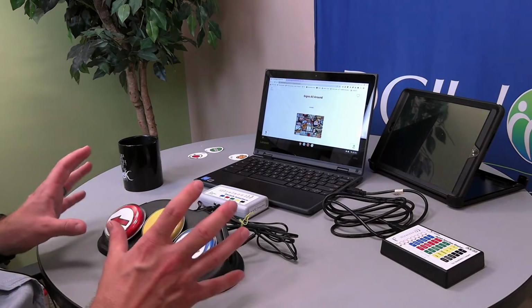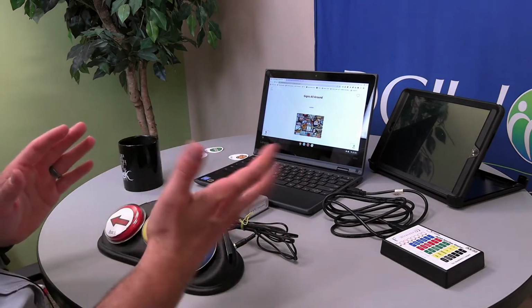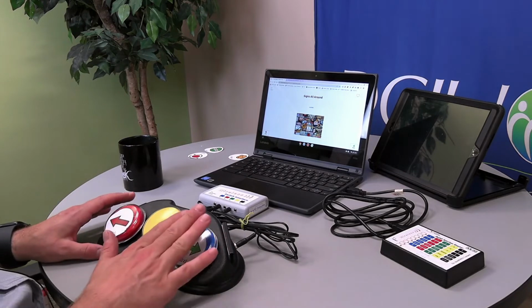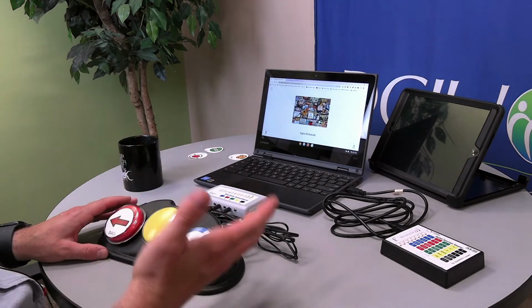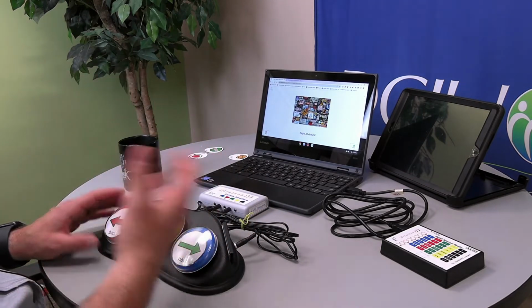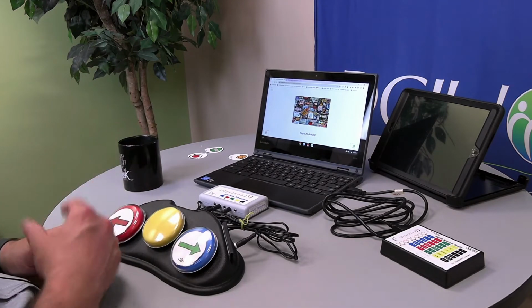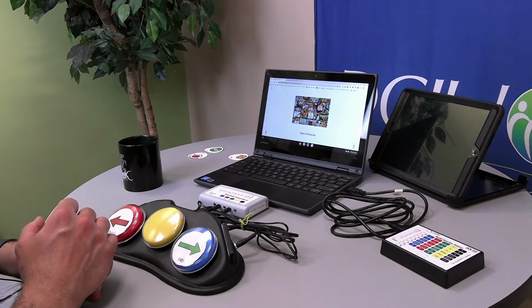Now that we have our device connected and we have everything routed to the computer, what we can do is simply press our designated next button and it will turn the page, and then the voice, if you have the volume turned up, you'll hear the person reading to you.